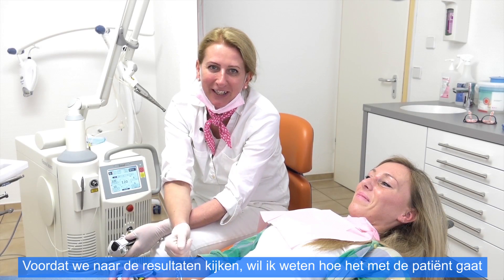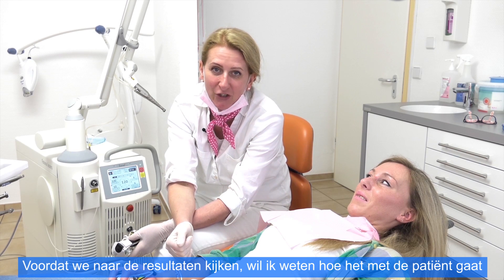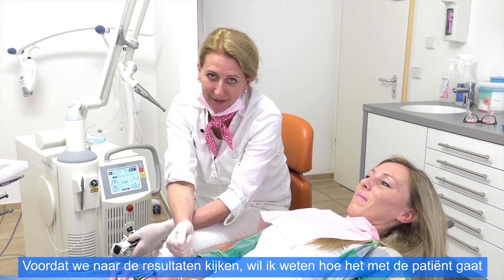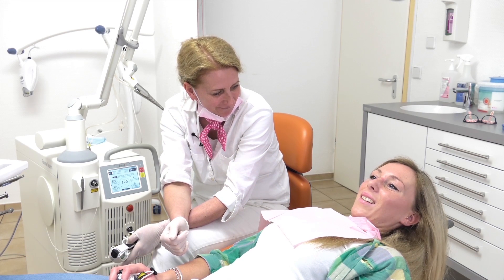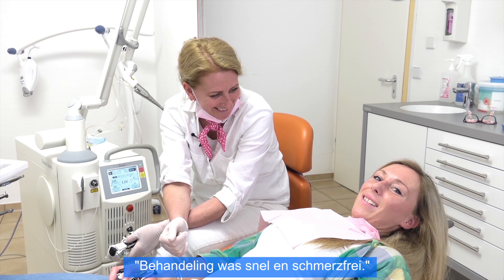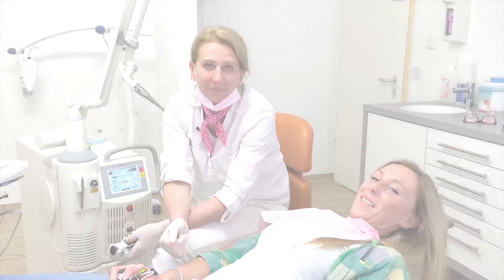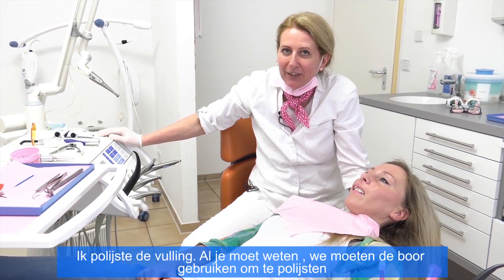Before I show you the results of the laser preparation, we will ask Jenny how she feels. So Jenny, how do you feel? I feel very good. It was very, very painless and very fast.